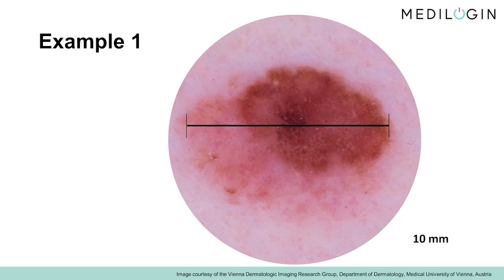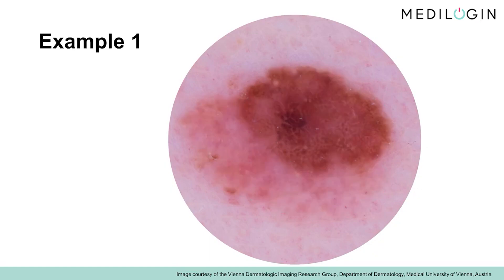Let's take a look at the patterns now. The lesion consists of two parts, a dark and a light pigmented area. The dark pigmented area consists mainly of clods, and has a slightly checkered color. The light pigmented area is partially structureless. In addition, you can see some small dots. You'll remember that if the lesions are only mildly pigmented, you can judge the vessels better, and should use these as an additional criterion. In the entire light area, you will find dot-shaped vessels, fitting for a flat lesion. Dot-shaped vessels which do not fade under pressure of the dermatoscope are indicative of melanoma.